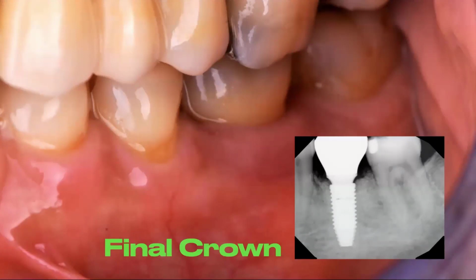And on the radiograph, that's pretty perfect when it comes to implant dentistry. We have the right size of implant for the right size of tooth at a proper depth with an emergence profile that's pretty even on both ends. It looks like a mushroom, looks like a flower, looks like something that's in nature. Nature always has symmetry, right? We have the stalk of a tree or the trunk of a tree, and then we have the branches of a tree. Well, an implant should be no different.